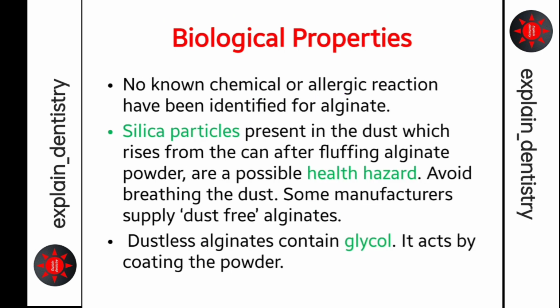Biological properties: no known chemical or allergic reaction has been identified for alginate. The silica particles sometimes form dust, which can cause a health hazard. Avoid breathing the dust. Some manufacturers supply dust free alginates. Dustless alginate contains glycol that coats the powder.